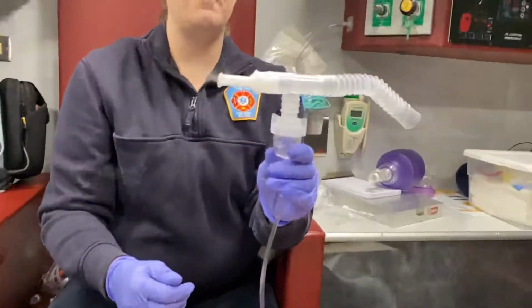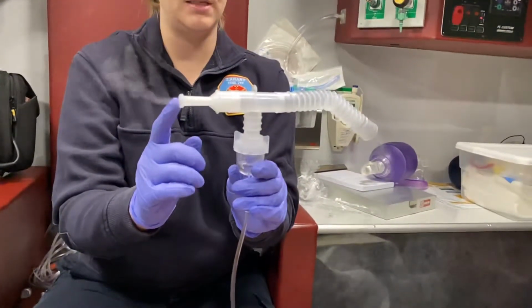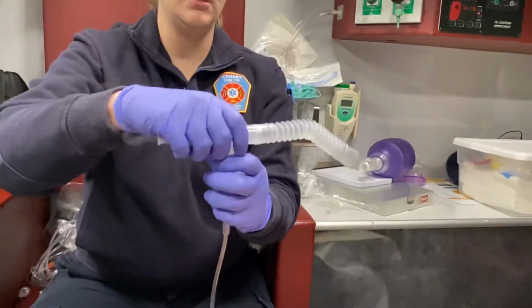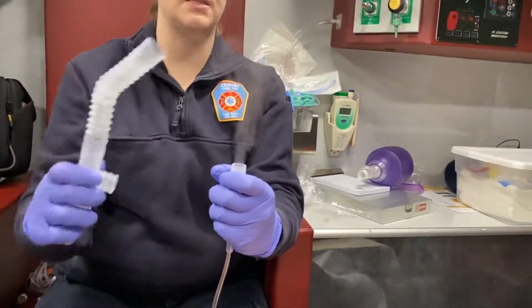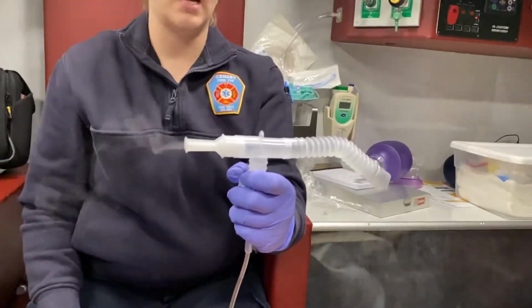And then you just give the patient this to hold, and they'll breathe in the mouthpiece here. If they're not able to hold this, if they're too unstable, this does come off, and there is a face mask piece that you can put on there for those patients, and it goes on their face just like a non-rebreather.